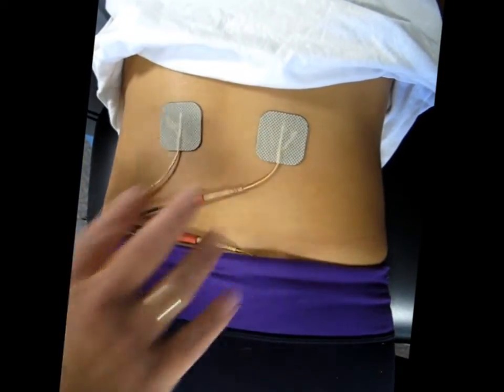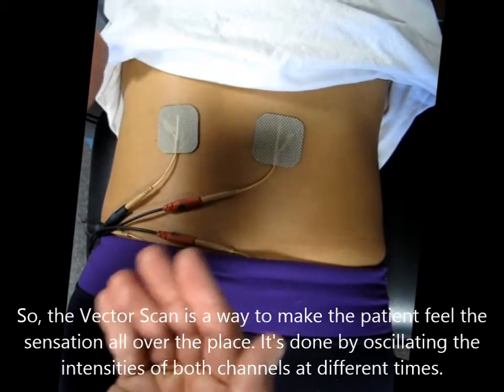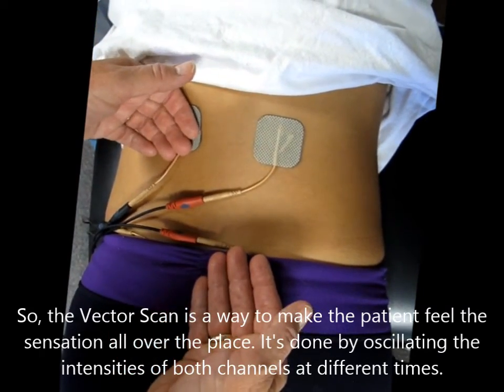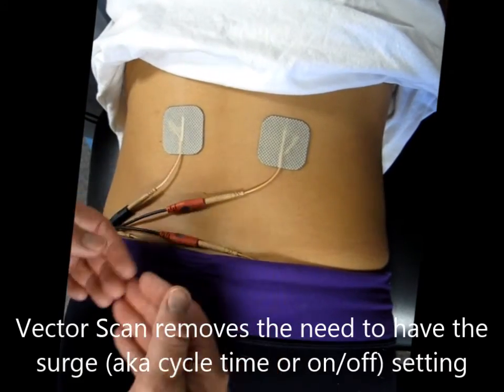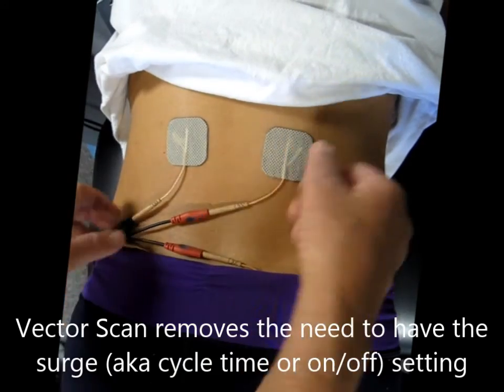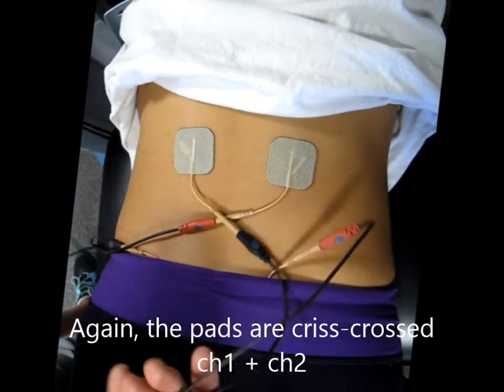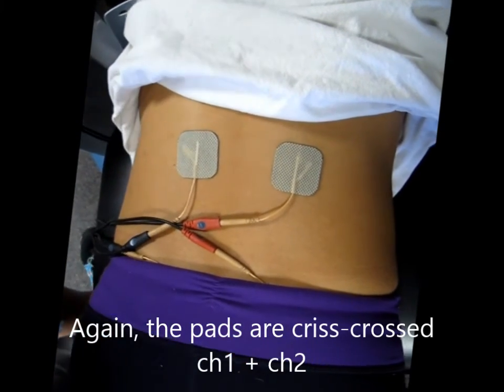It should be going off and on and sweeping on and off. When you have the vector scanning with intensity levels that are stronger and then less strong, that will cause a prevention of accommodation. Plus, it removes the need to surge with the cycle 5 on, 1 off. This is channel 1 and this is channel 2. And that's pretty much it — thank you.